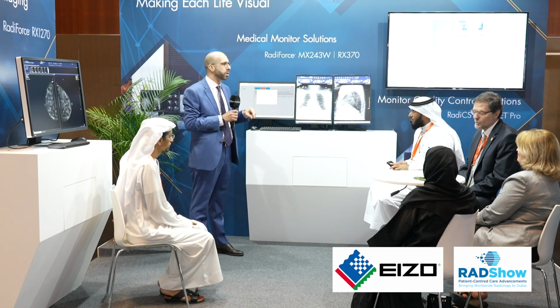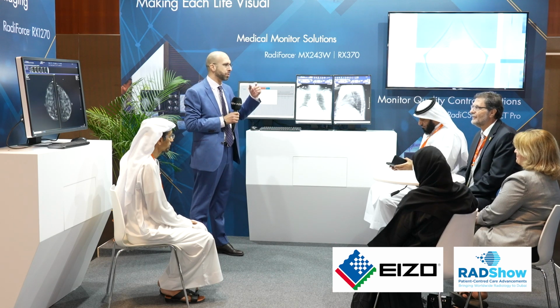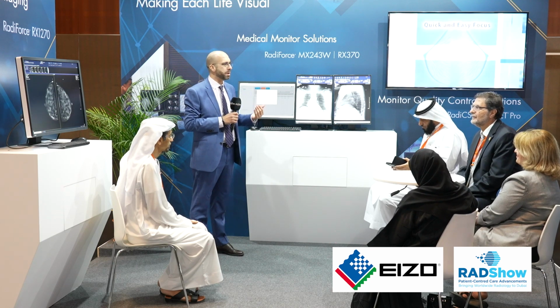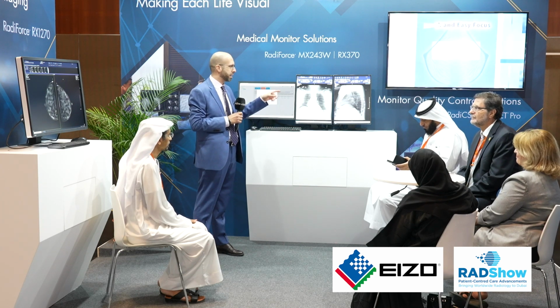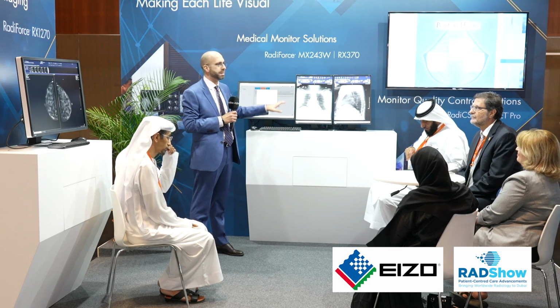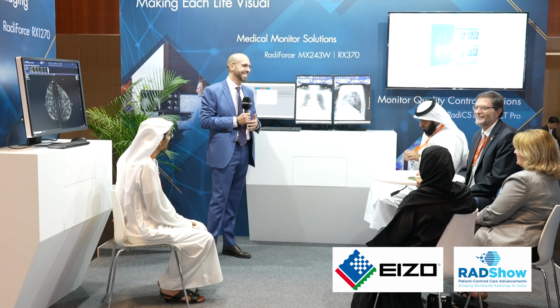So the user should do some specific tests every morning, because sometimes you wake up and your eyes are tired. There are some details that you cannot see today, so you have to check. If you don't see, then you should not do any report or self-calibration.